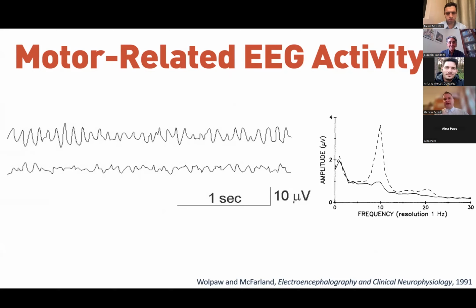We've heard about this earlier, like coherence and things like that. Now, when we do that, and the more of this mathematics we are applying, the more assumptions are implicitly baked into the analysis, without us really knowing what the EEG actually looks like. I was really refreshed by Brad Wojtek's talk, who talked about coming up with new methods to quantitatively describe the EEG, which I think is really something that's very much necessary.